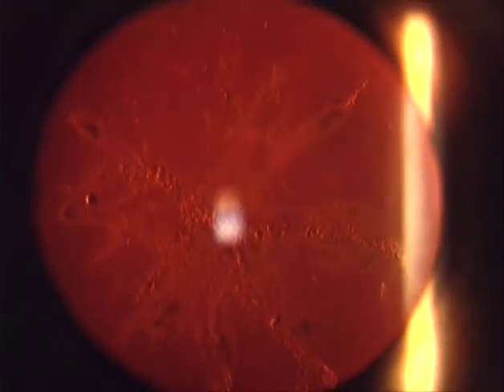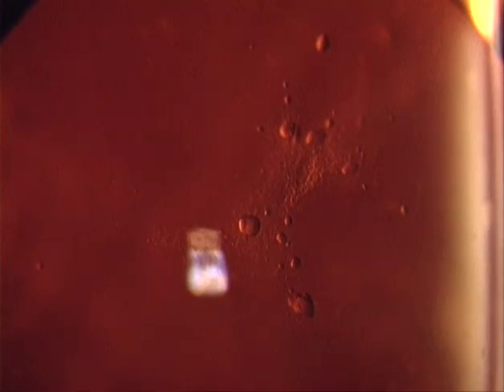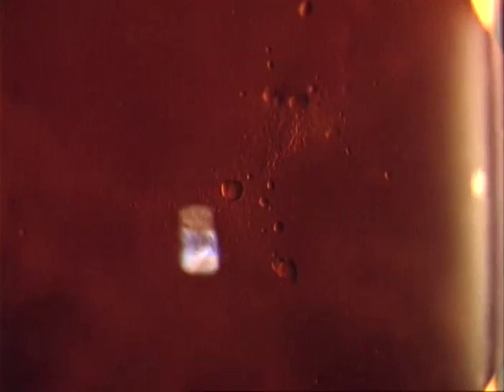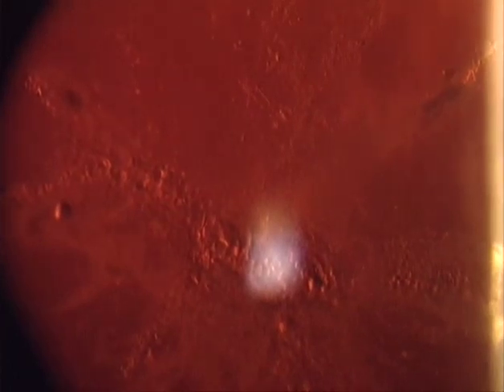Then magnification is increased for determining the exact position of a specific lesion. Since high magnification reduces the depth of focus, objects are only seen at one level. Here only, the anterior subcapsular cysts are in focus, while the posterior subcapsular lesions are barely visible. The distance between them is estimated by shifting the microscope backwards, which brings the posterior lesions into sharp focus, while the anterior cysts become unfocused.